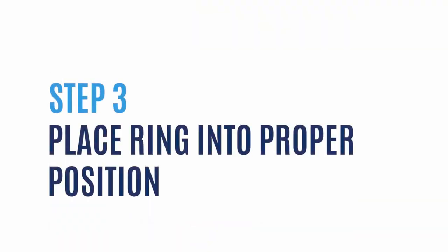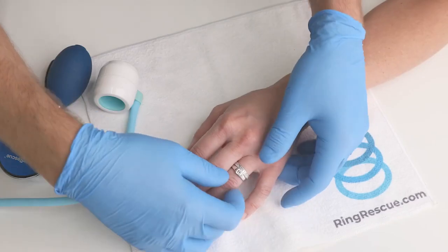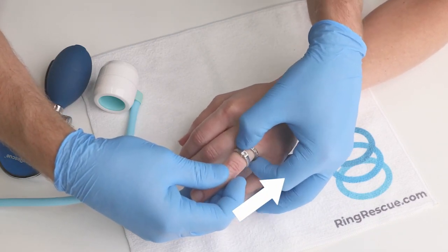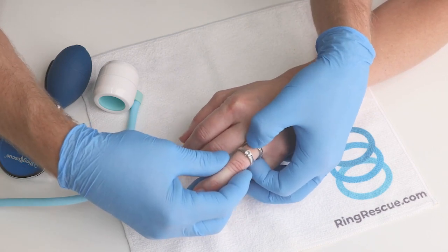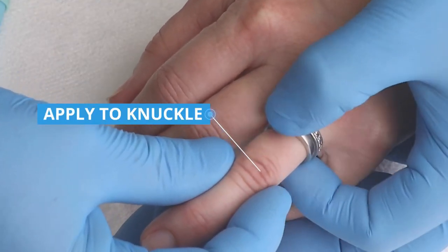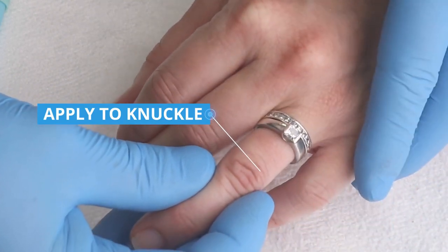Step 3: Place the ring into the proper position. Now, let's push the ring back to the base of the finger. This will allow you to place the device over the maximum area of swelling. In some cases, you won't be able to get the ring all the way back, but that's okay. In those cases, let's apply the device over the knuckle.